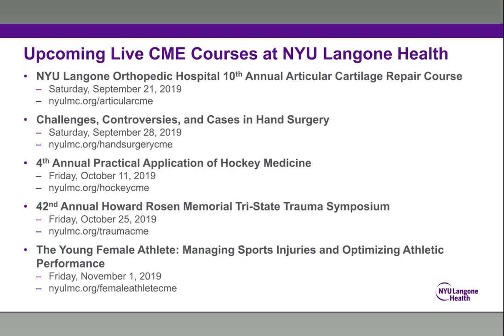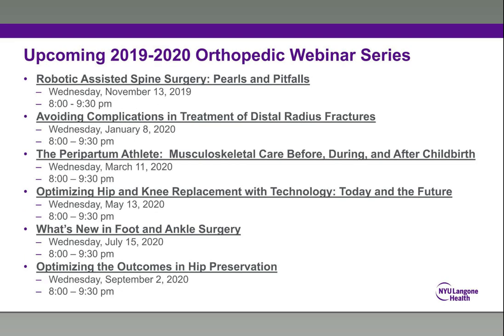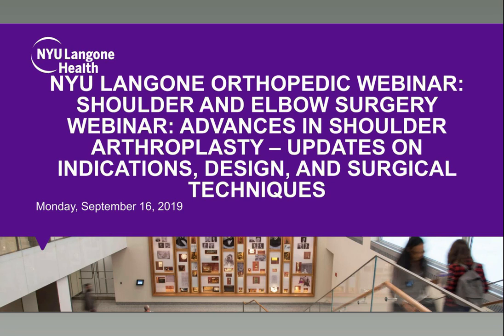I think this would be perhaps in a revision situation where the glenoid just cannot tolerate or is not big enough with enough bone stock to tolerate a component. And then perhaps we put in a hemiarthroplasty, but I think for the majority of cases, that's going to be pretty rare these days.